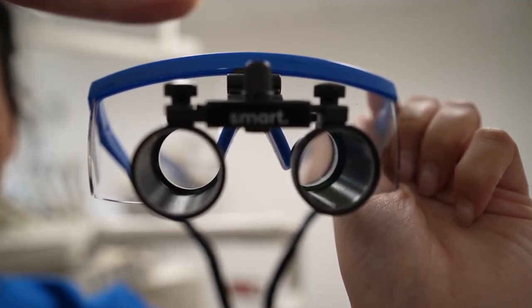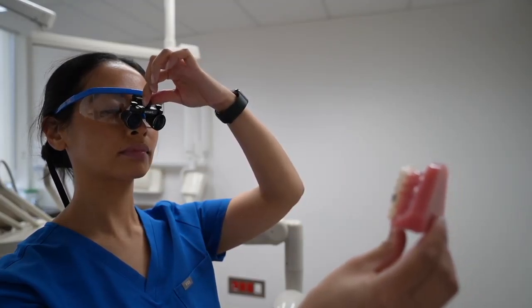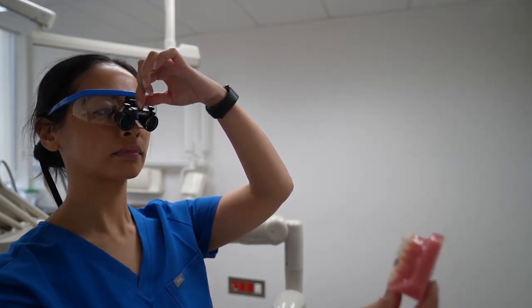Setting your interpupillary distance. Adjust the middle dial to the maximum, then sit comfortably while looking at your object. Rotate the middle dial slowly until the two circles that you see become one. You're all set.